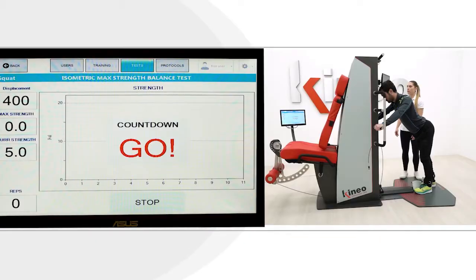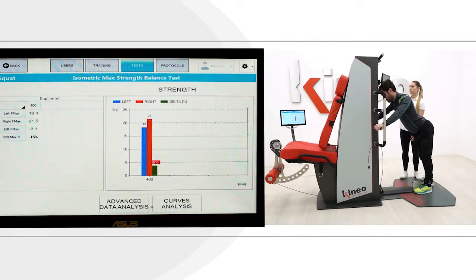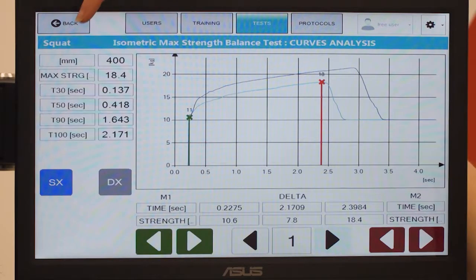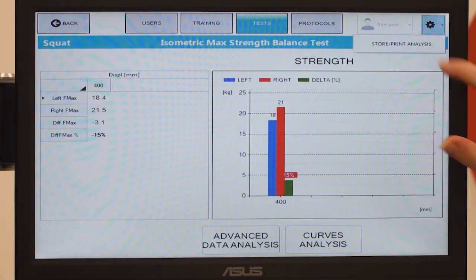Kineo can process the data in histograms for peak isometric values in terms of peak isometric strength of the left side in blue and the right side in red, showing the inter-limb difference in percentage.